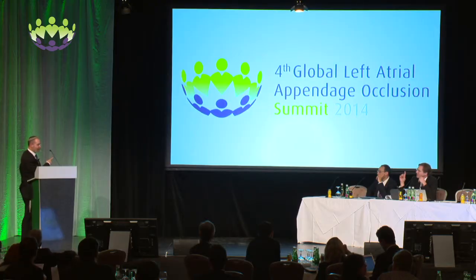In practical day-to-day life, I think that there is benefit in extreme cases. But the information that I received today from the transesophageal echo, and we have a fantastic level of transesophageal echo, is not enough for me to pick those extreme cases. I would not have determined that unless you were looking at those images, right? The discrepancies. In the majority of cases, you don't pick it.